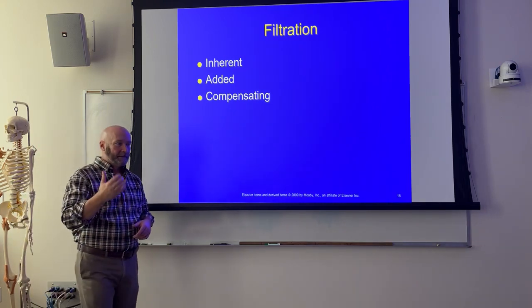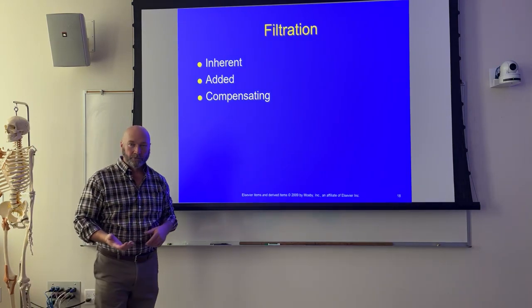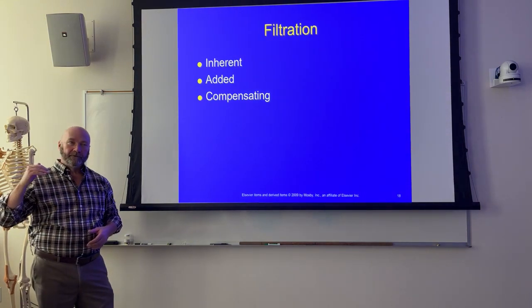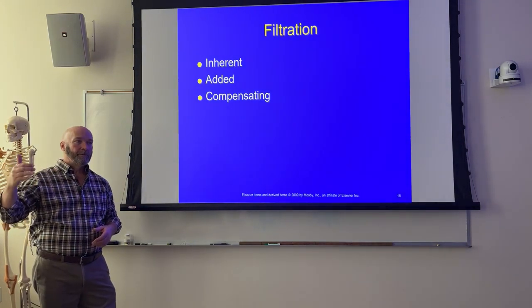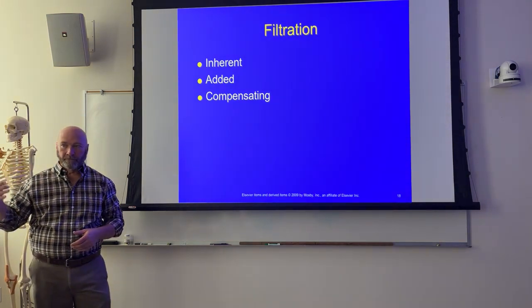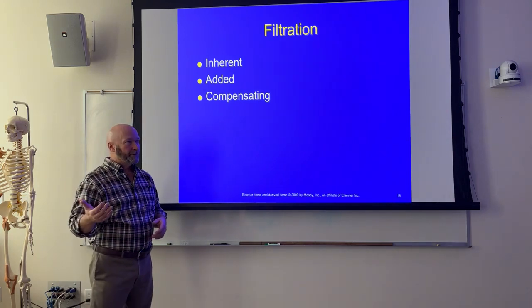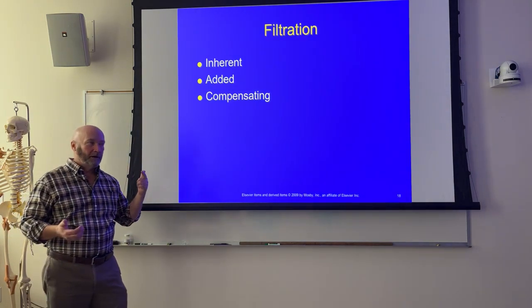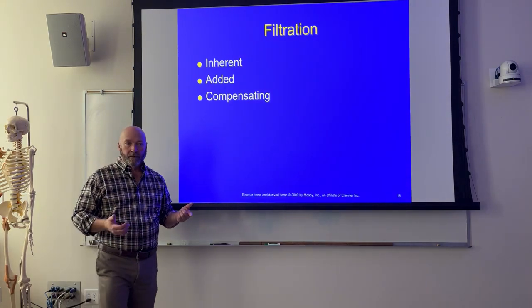So what that is on your diagnostic tubes, which is all you're going to be working with, is if your machine is capable of producing 70 kVp, then you need a minimum filtration of 2.5 millimeters of aluminum equivalent, right?